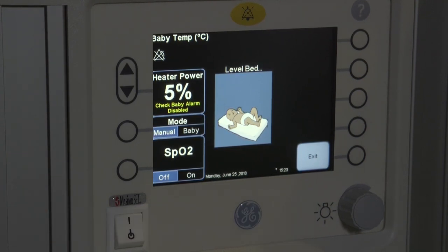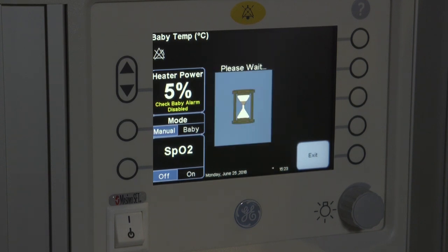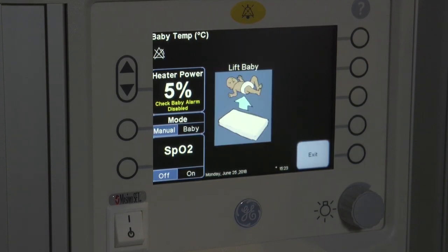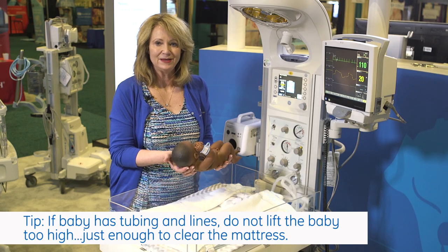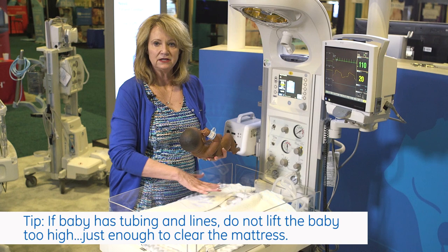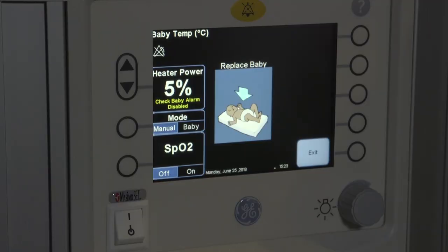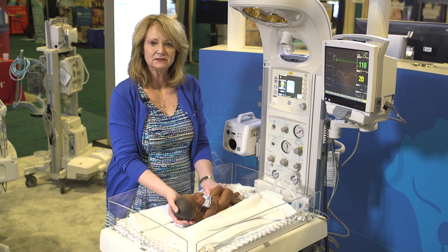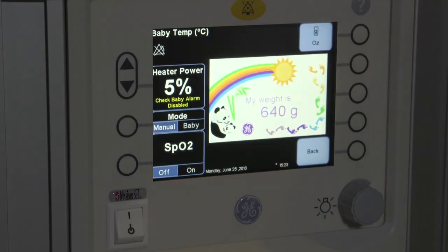It's asking me first to level the bed, and I have done that previously, so the bed is level. Now it's asking me to weigh. Now it's asking me to lift the baby. When I lift the baby, everything on top of the mattress is zeroed out. Now it's asking me to replace the baby, and once I replace the baby, it will be obtaining the weight for us.